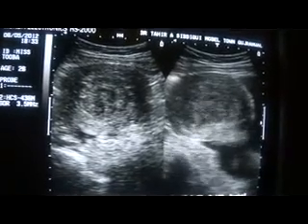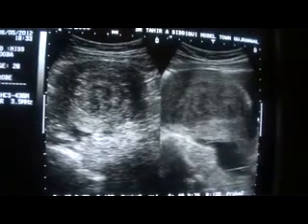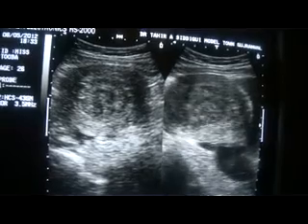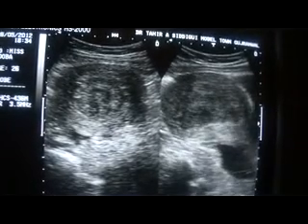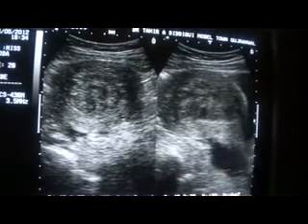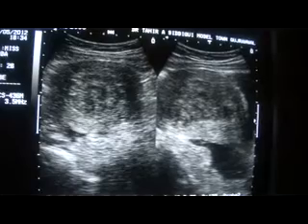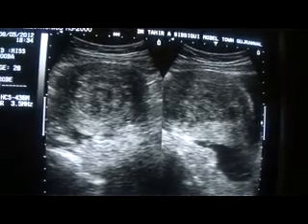Now, proceeding a bit further, let's see the myometrium in total. This is the cervix. The lower part is the cervix. This area is the cervix, this is the cervical canal. This area is normal.